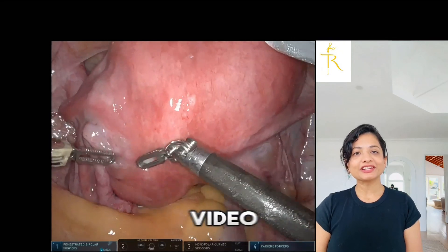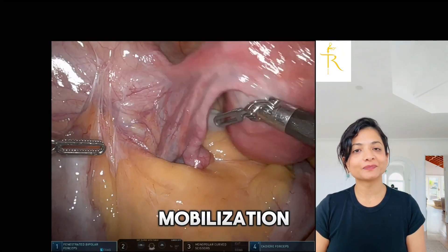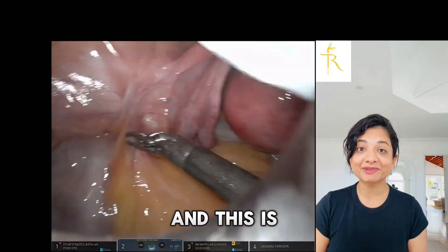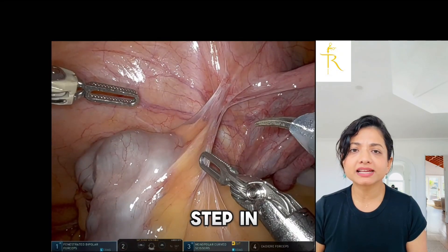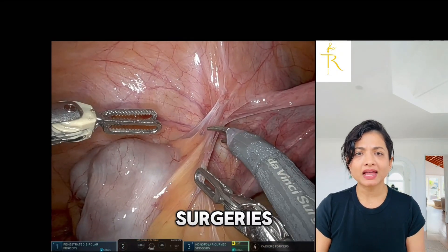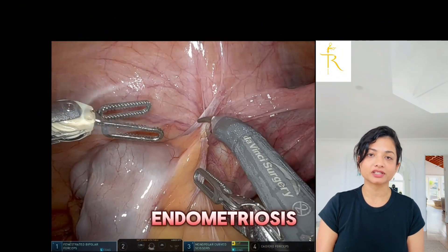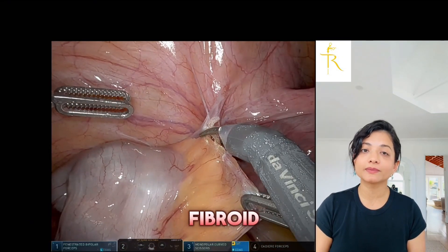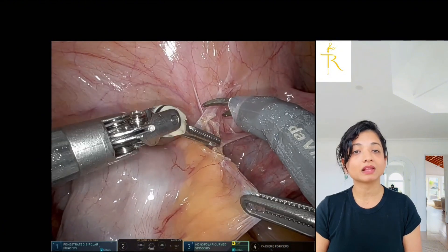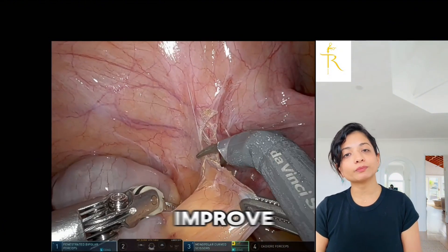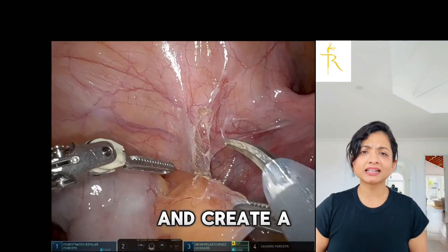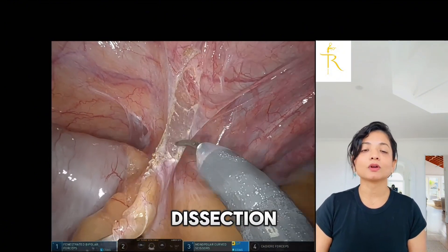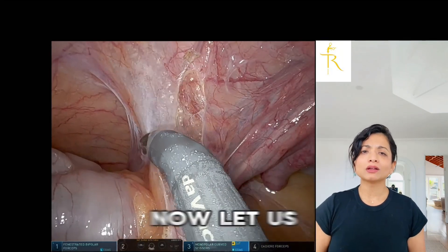Hi everyone, in this video I will demonstrate sigmoid mobilization and how to safely access the left ureter through this approach. I'm Tanu Rao and this is my YouTube channel. This is a crucial step in complex gynecological surgeries, especially in cases of deep infiltrating endometriosis or pelvic malignancy. In this video we are using this technique for a multi-fibroid uterus with a broad ligament component. Our goal with sigmoid mobilization is to improve exposure and create a clear surgical field, particularly when performing ureterolysis, bowel dissection, or resecting endometriotic nodules.